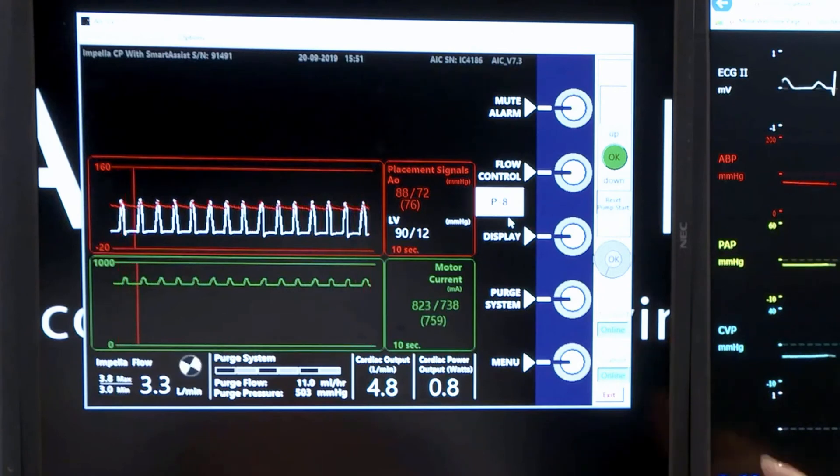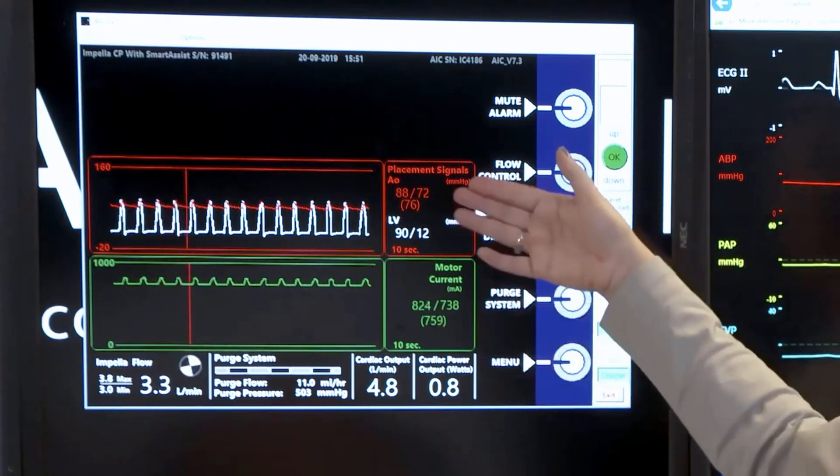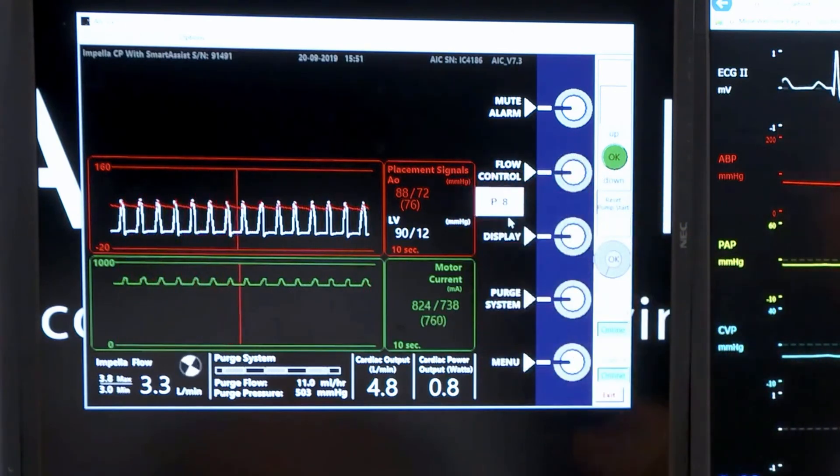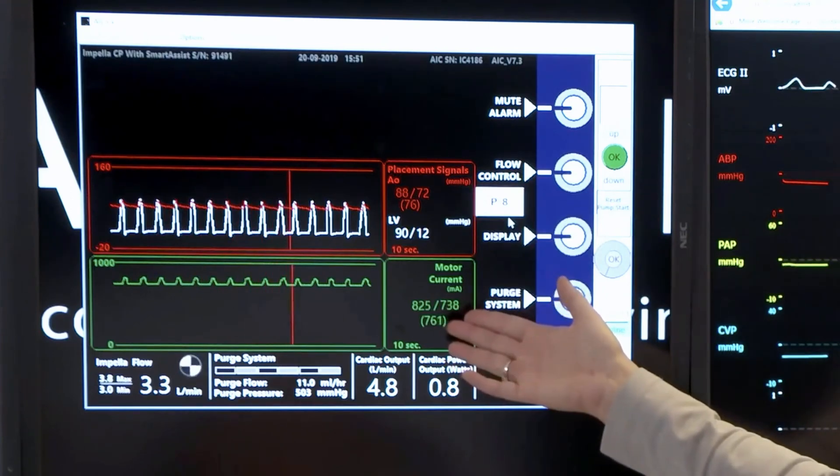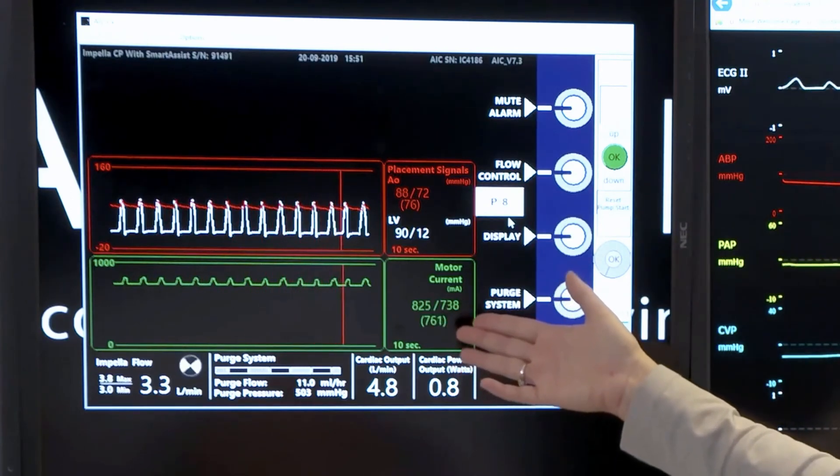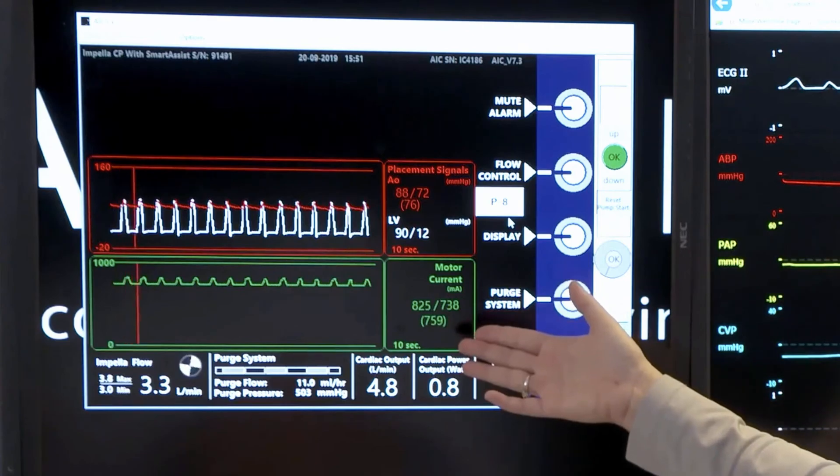As we look at the waveforms that we see on the placement screen, you'll notice that we have a green waveform, which is our motor current. The motor current is going to help with identifying positioning of our device.